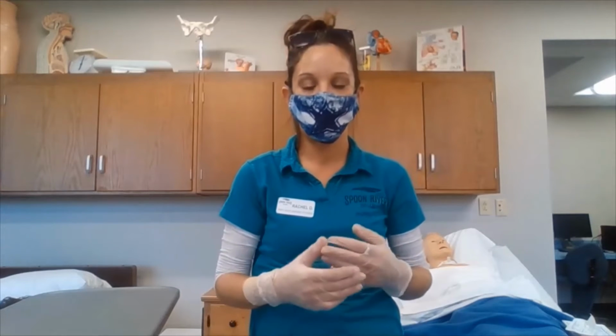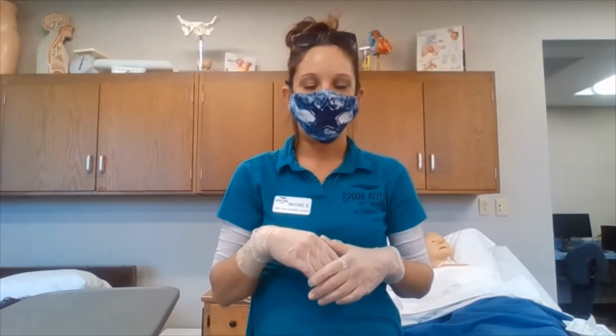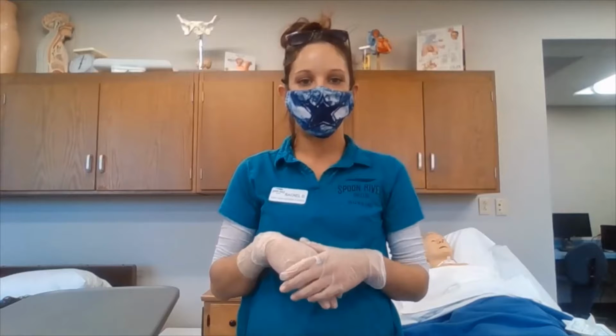For a small bore tube, we are going to be inserting either the stylet or guide wire into its proper position according to agency policy. If it is already inserted into the tubing, we will not be removing it until after verification of placement of the tubing by x-ray. After removal, we are not going to be reinserting it. So after selection of our tubing, we are going to be preparing our other supplies.